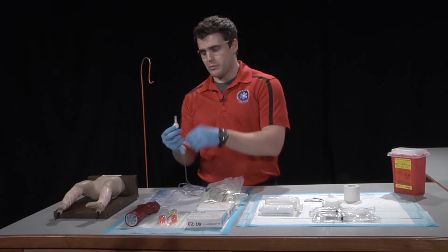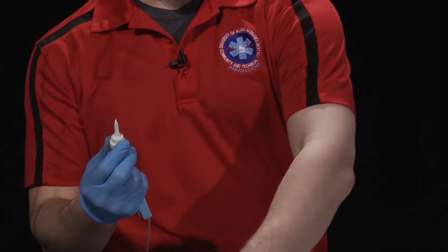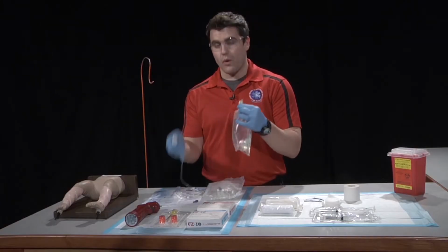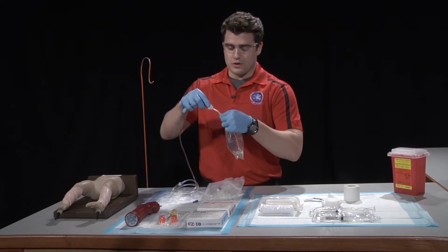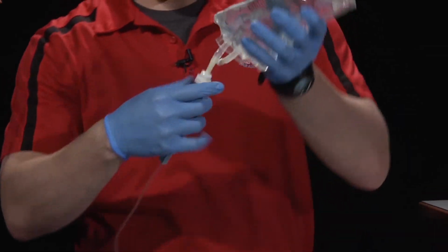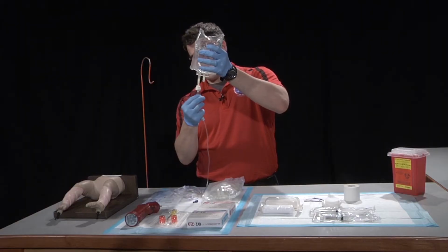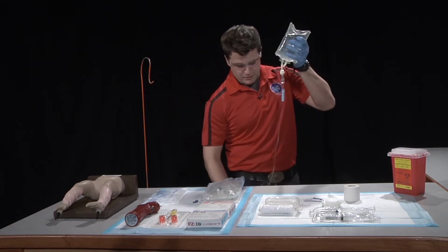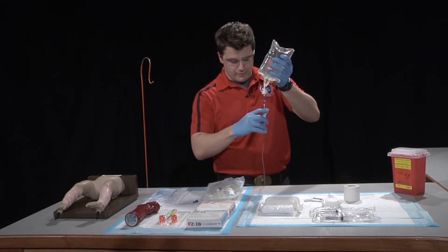From here, we're going to remove the protective cap from the administration set, as well as the saline bag. While maintaining sterility, we're going to puncture the seal, turn our bag upright, squeeze our drip chamber, filling it halfway. From there, we're going to bleed and purge all air from the line.